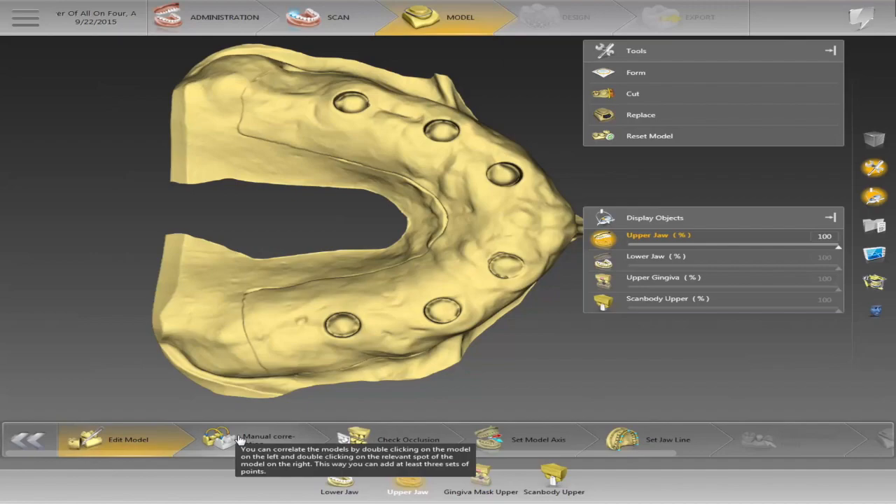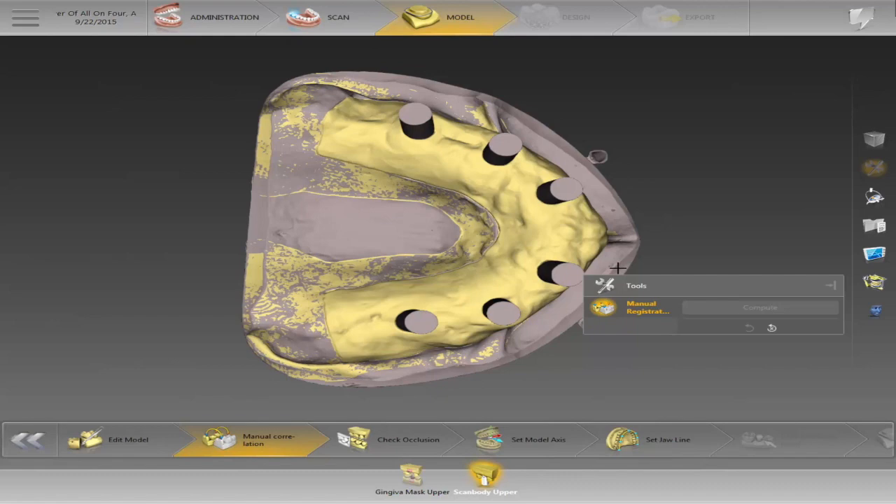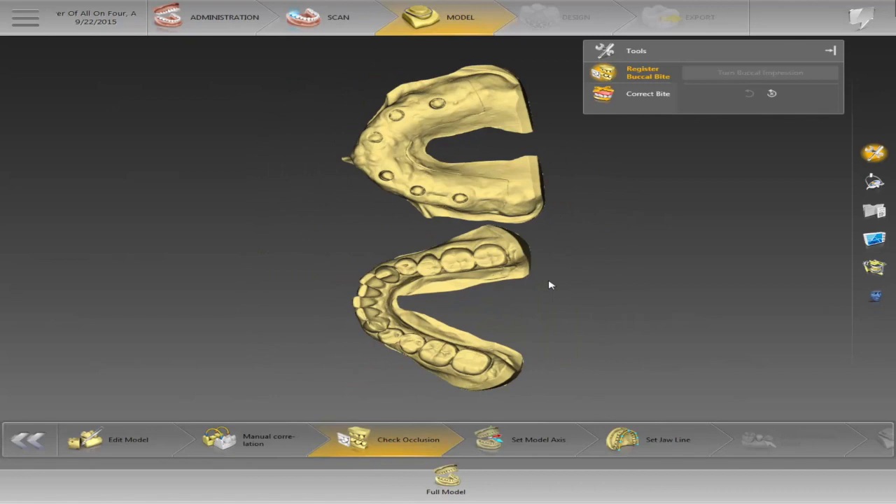Once we move forward and start the case, I can edit my model. Once you have all the catalogs, every catalog is overlapping each other — you can see how they're overlapping on all the different catalogs.